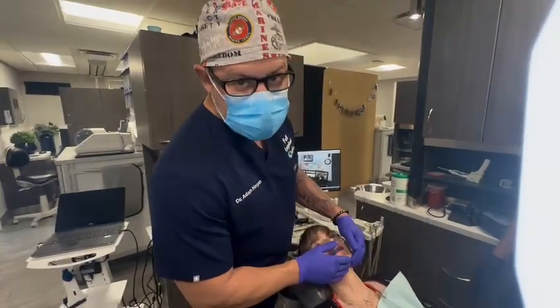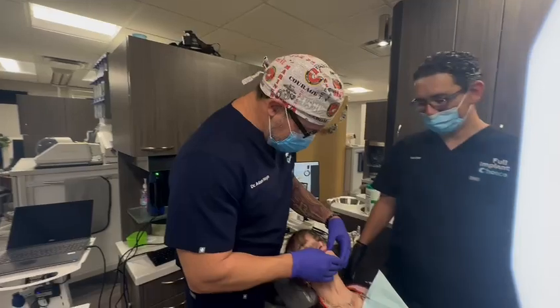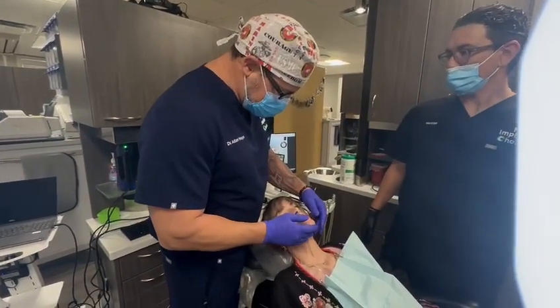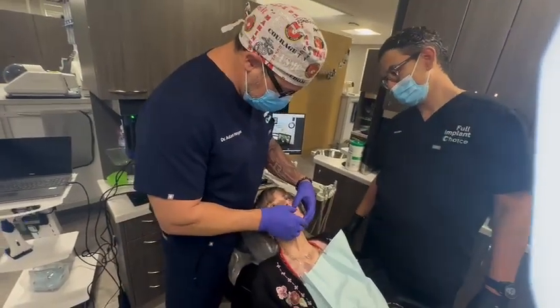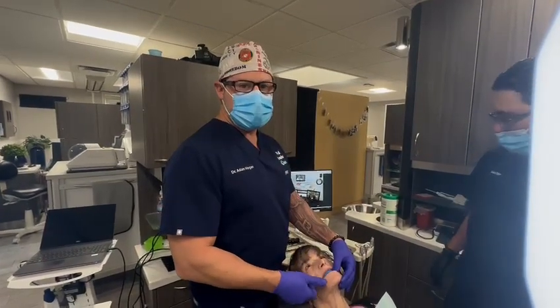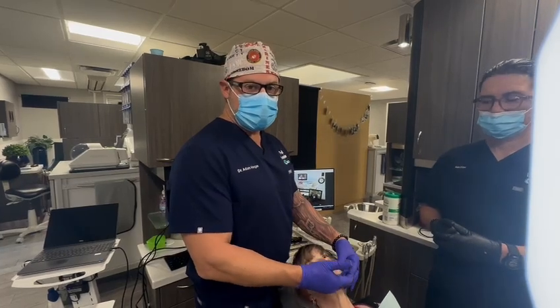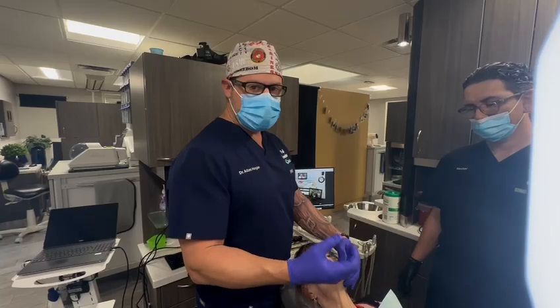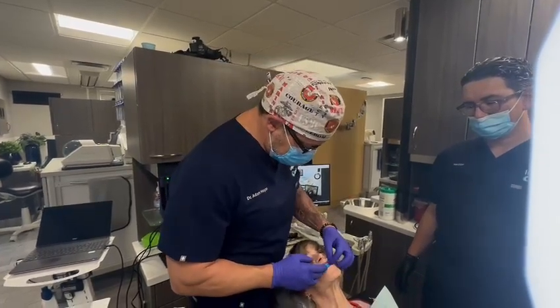You've got to deal with the people. It's not about teeth, it's about people. The old traditional wax rim approach is another way to go. What's going to happen afterwards: we'll do a CT scan, check the condyles, do a facial scan, do photos, and then we'll scan in the mouth and scan the bite. If we have good soft tissue and pick up those rugae, that'll be a good alignment for the digital design to get our new smile.